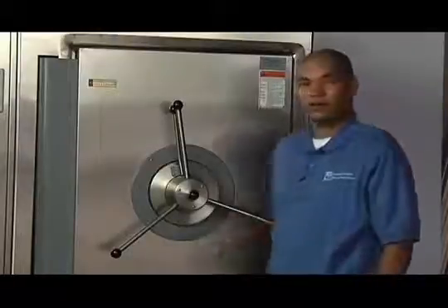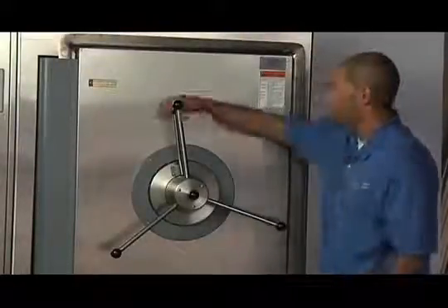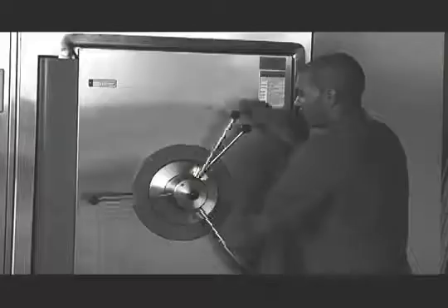After your goods have been loaded in the sterilizer, on larger units begin by turning the tripper handle, which is located behind the hub, to the right. Then begin turning the main hub clockwise like so.